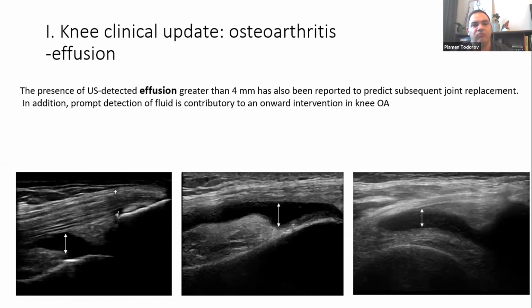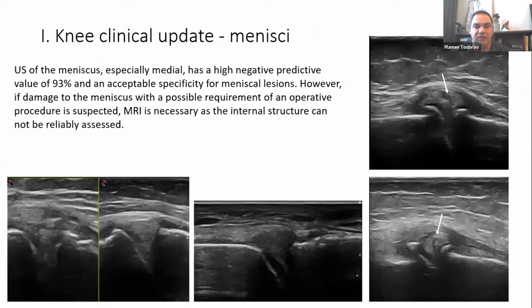In addition, prompt detection of this fluid is of course contributory to an onward intervention in the knee, whether with injection or some other methods.